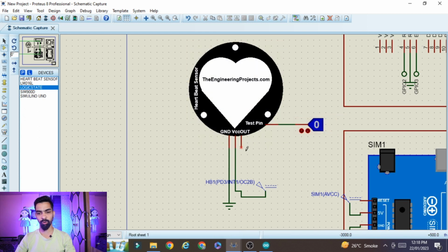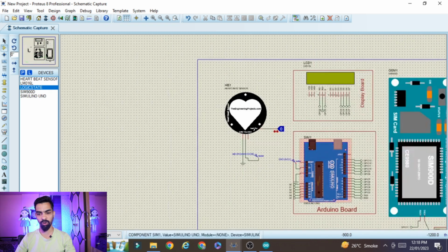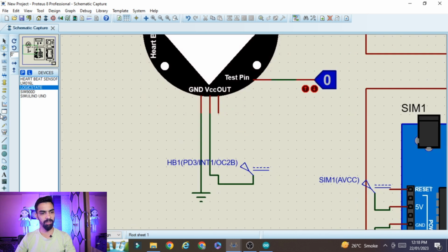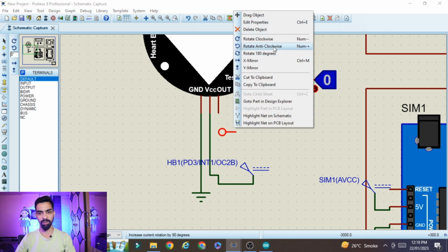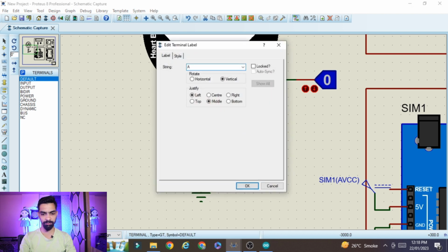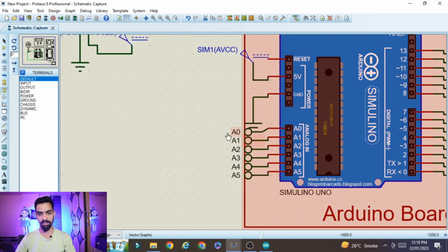Then this output pin should be connected to analog 0 of Arduino. So you can see this analog 0. We need one default pin. So go to terminal mode, click on default pin, and place it here. Right click, rotate 180 degrees, and connect that default pin like this. Double click on the default pin and give the name A0, because we are connecting to A0, as you can see the default pin name is A0 here.